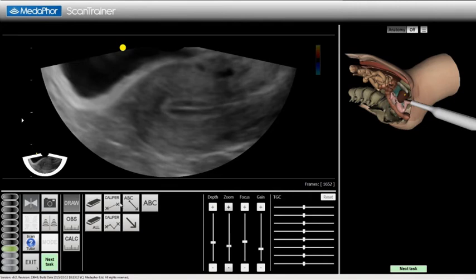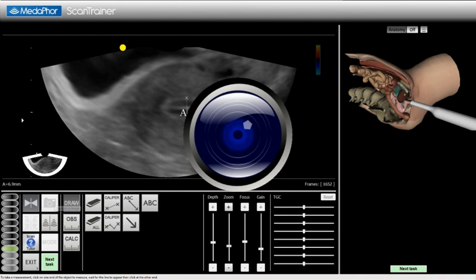Measure the endometrium in its maximum thickness. I now measure the maximum thickness of the endometrium. I find the thickest portion of the endometrium perpendicular to the endometrial midline. I then place the calipers at the level of the two opposite endometrial-myometrial interfaces. I then capture an image and unfreeze the ultrasound image.